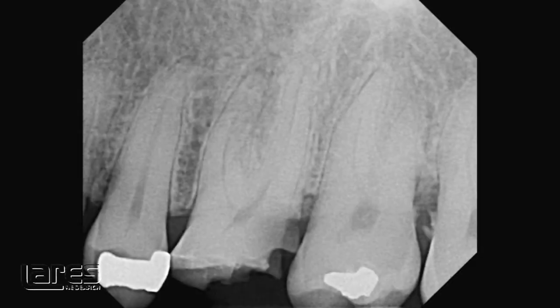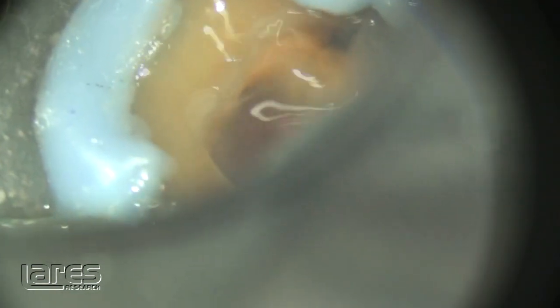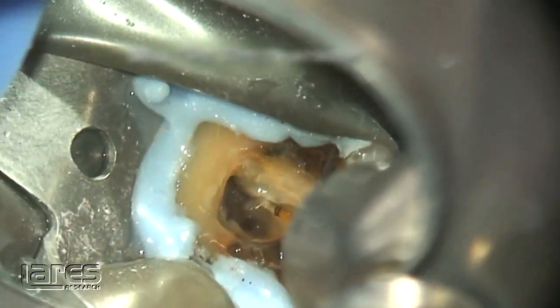Here's a case showing more PIPS. We're going to show you more videos of PIPS itself — upper left molar, using the PIPS tip for the power lase, placing the tip into just the orifice, cleaning out the mesial buccal 2, and watching the material flow out of the mesial buccal 1. You can see the entire chamber — everything's moving in the chamber.